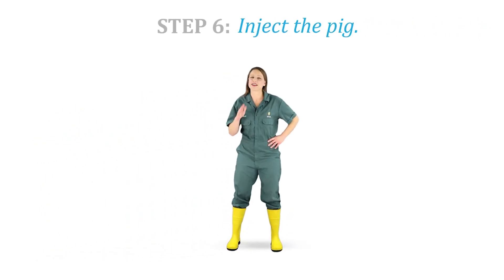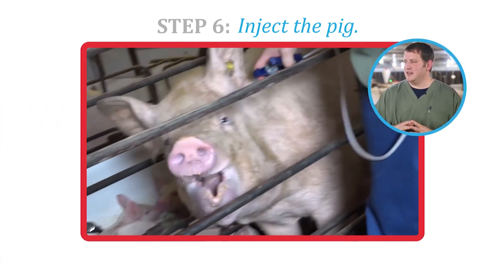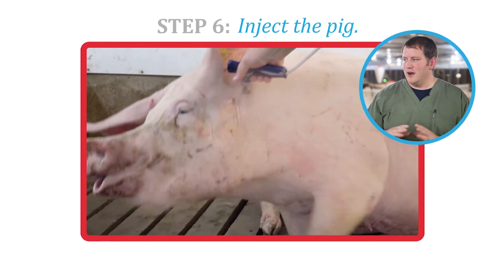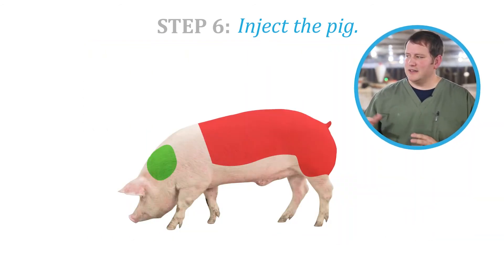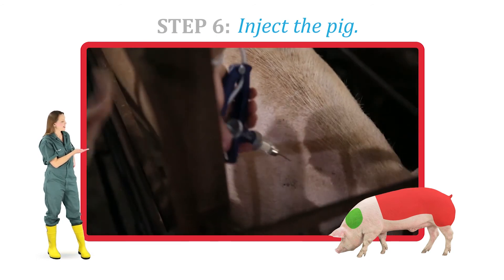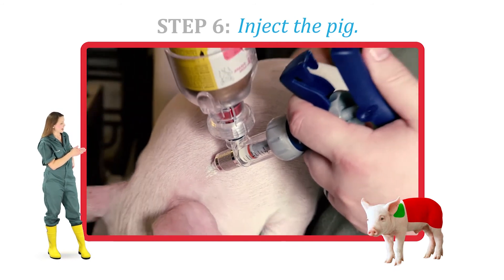Step 6. Inject the pig. Intramuscular injections are the most common injections we use in pigs for both treatments and vaccinations. When injecting any size pig, we always want to inject in the muscle behind the ear and the neck. We always want to avoid injections in the ham or the loin, unless directed by your veterinarian. The angle matters — notice how in these stalls we are injecting to properly hit that muscle, whereas in weaned pigs we inject at a different angle.